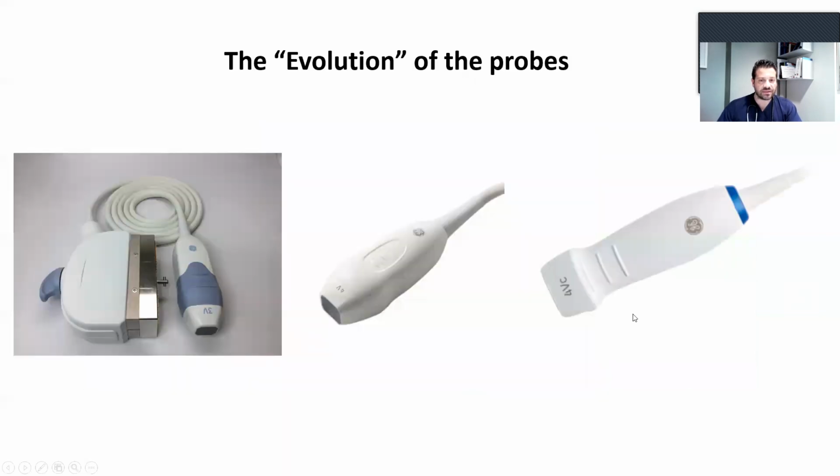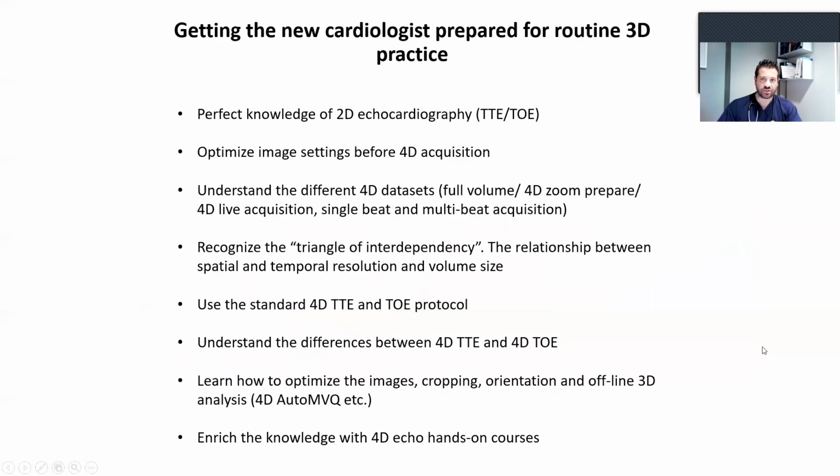It is very important that the probes also have a reduction in size, and the concept is now to have one probe for everything, for 2D and 3D echocardiography, and not to change the probes during our examination.